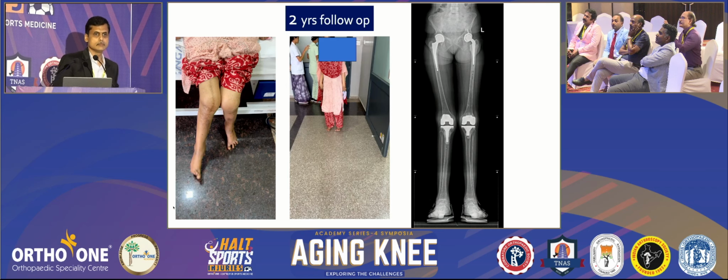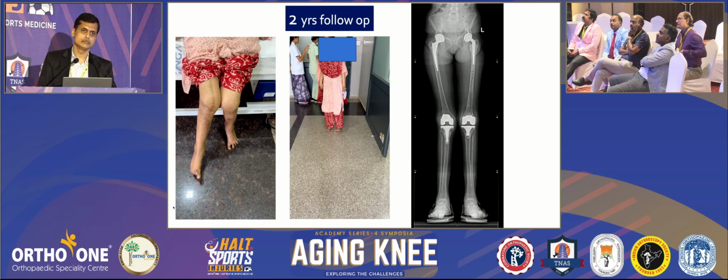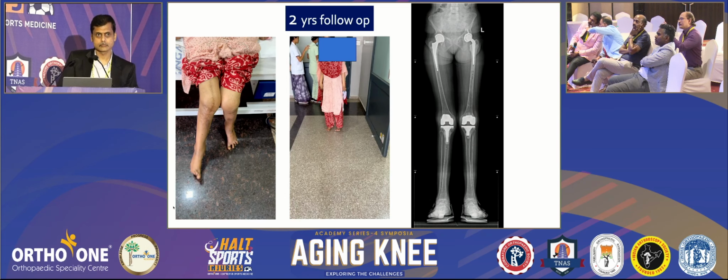I think the skin incision has to be slightly lateral to the center to avoid this. If you are doing a lateral parapatellar approach, the skin incision should not be centered on the center of the patella. It should come more lateral so that the lateral flap is not big.